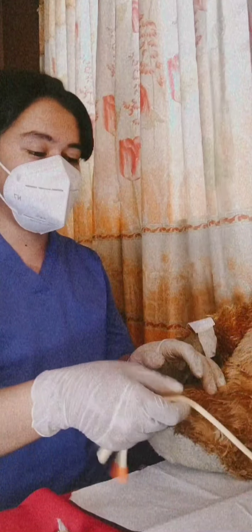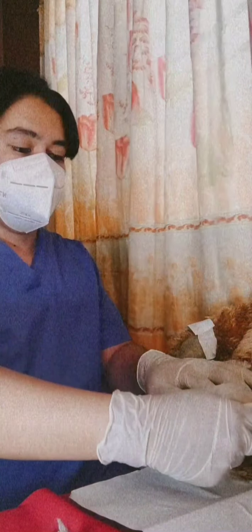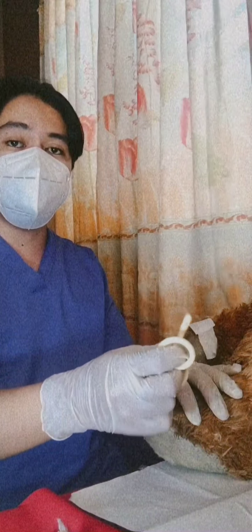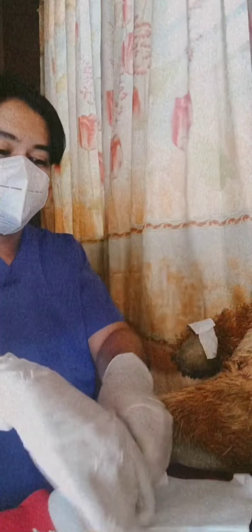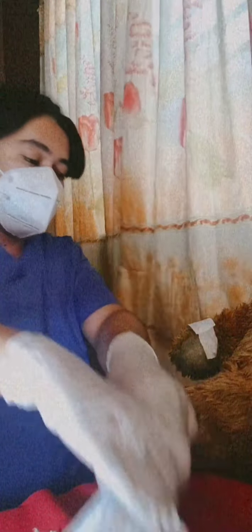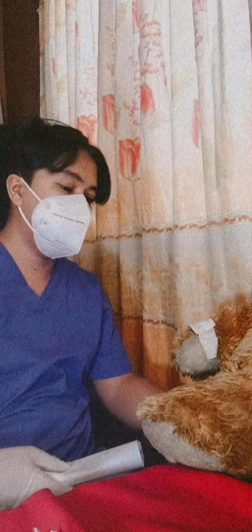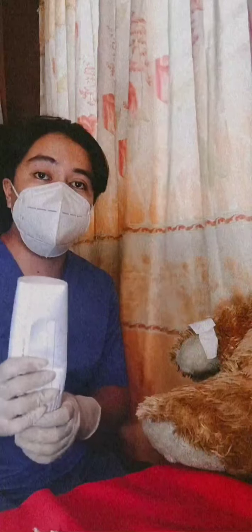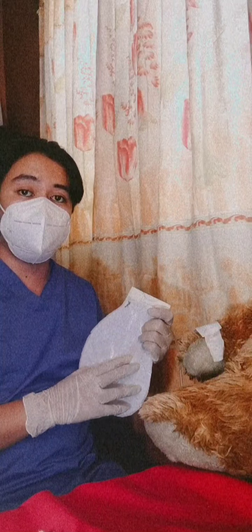Next, gently pull out the catheter, and then cover the contaminated catheter using the waterproof pad, and then unhook the tubing from the bed, and then discard the used materials in the appropriate receptacles. Next, we need to measure and empty the contents of the drainage bag.